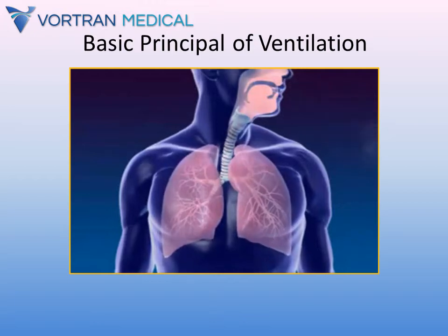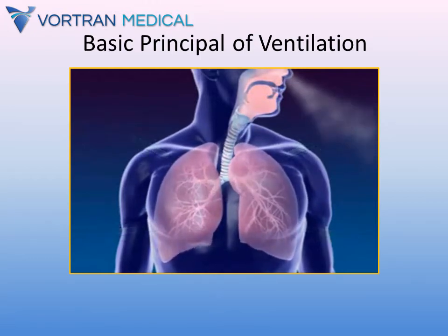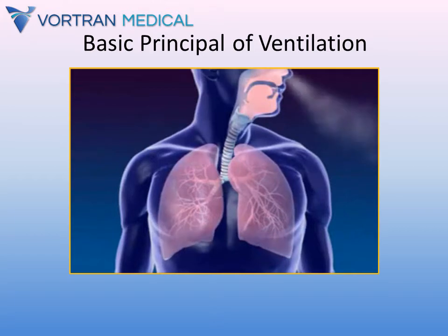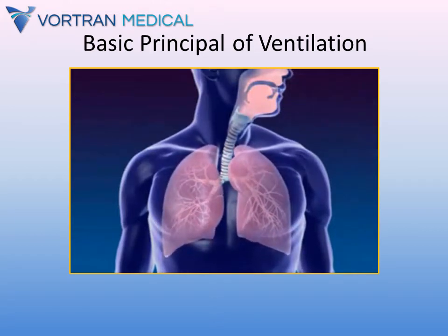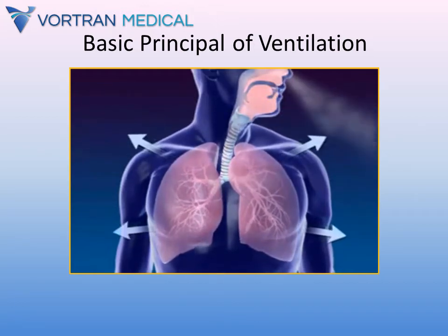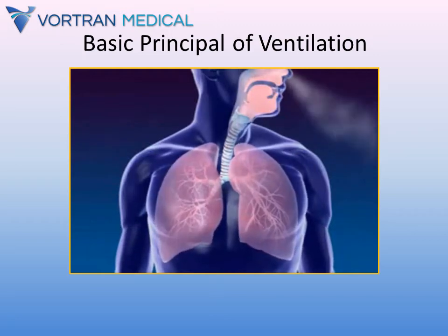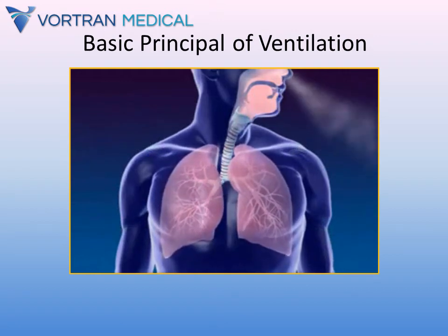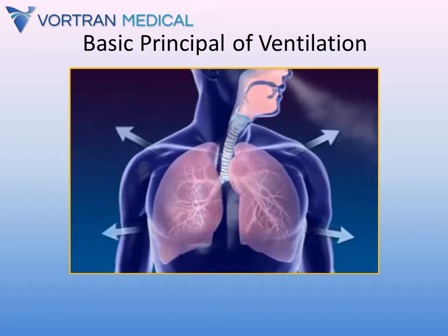The function of ventilation is threefold. First, we need to expand the lungs by providing a large enough tidal volume, exposing enough surface area to allow the gas exchange to take place. The second is to deliver more oxygen than is currently in the bloodstream to create the partial pressure gradient necessary for diffusion. And third, to allow the proper amount of carbon dioxide buildup to be removed through passive exhalation. If any one of these three functions are not present, you will not have adequate ventilation.